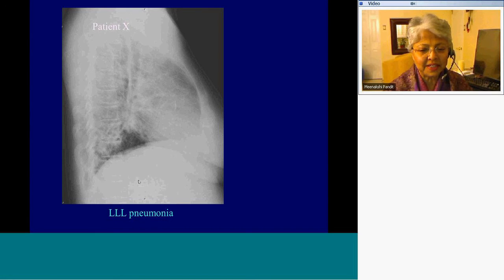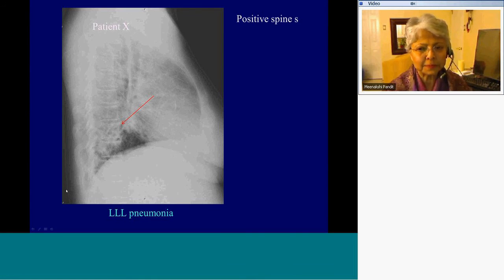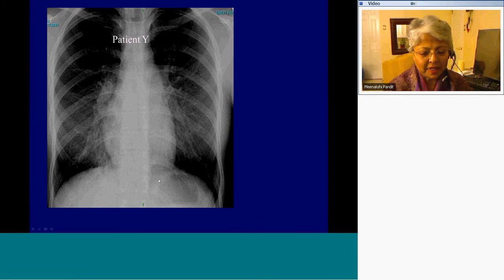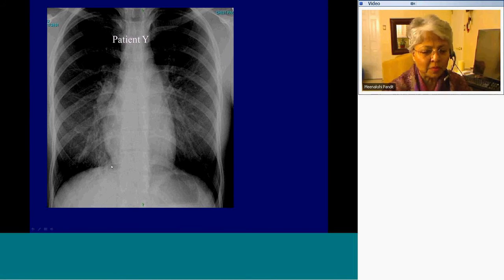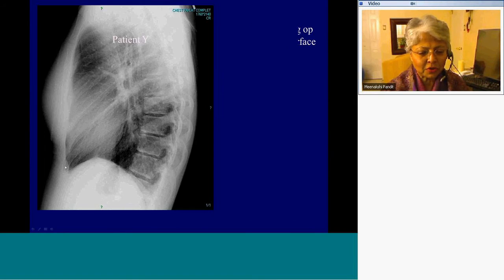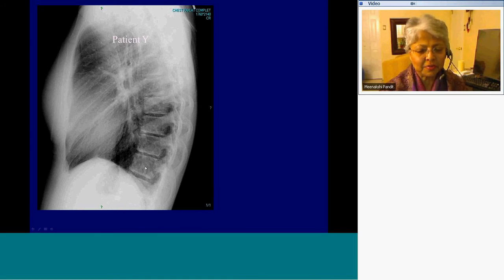Showing these very subtle cases because these are the things that affect quality of care. Here, it's abnormal on the right side where the paraspinal lobe is denser on the right — there is increased opacity in the right lower lobe zone. If you see that the azygoesophageal recess cannot be traced at a certain point, there is silhouetting of the azygoesophageal interface. This is right lower lobe pneumonia, and you can see the positive spine sign — denser vertebral bodies below, getting more lucent as you go up.